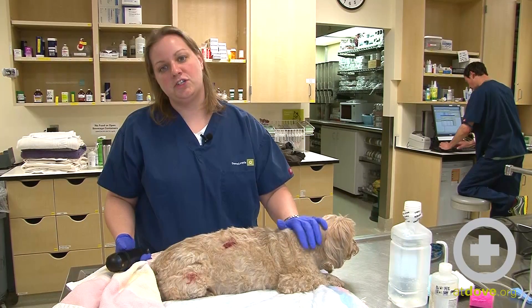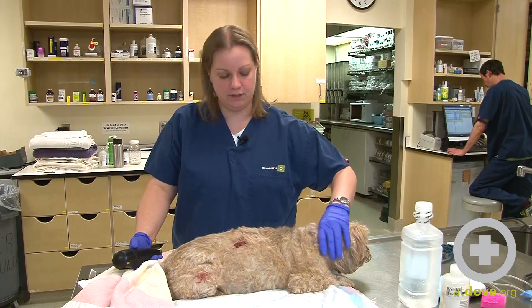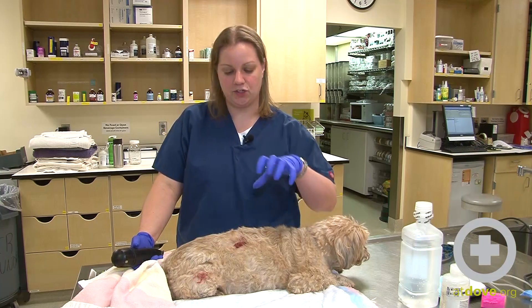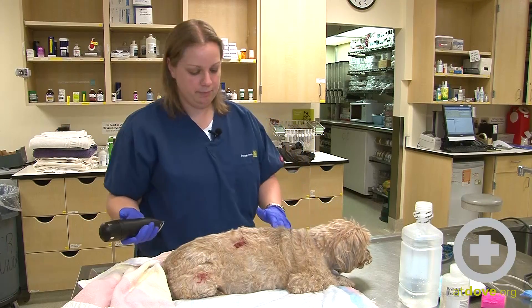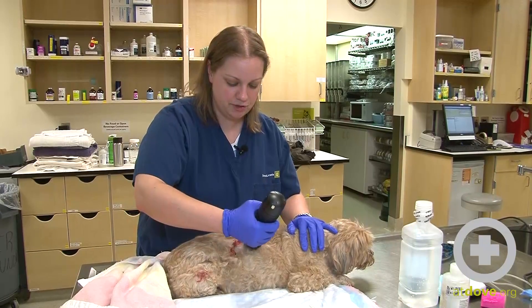He has been given some pain medication and a little bit of sedation. Anytime we're dealing with wounds it is painful, so we want to make our job easier and make them a little bit more comfortable. We've also taken some chest x-rays to make sure that none of these wounds penetrate his thoracic cavity, and everything looks good, so it's time to start clipping.